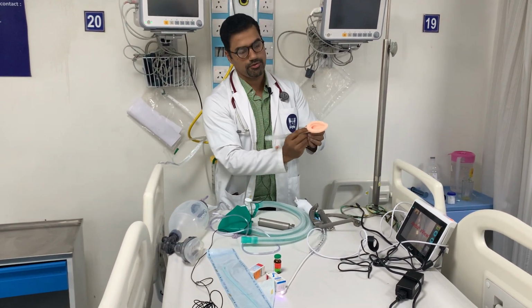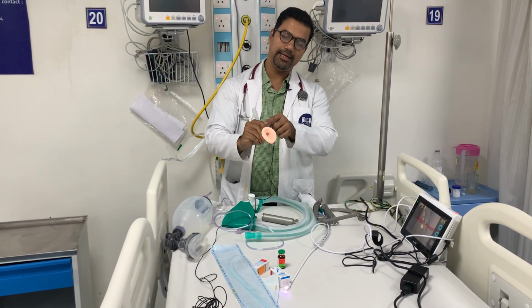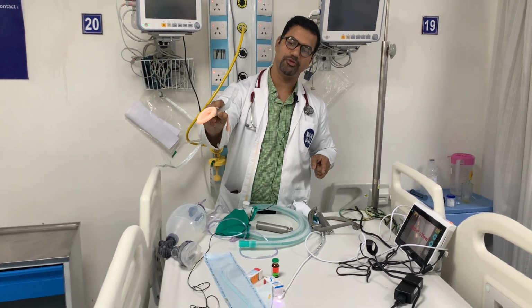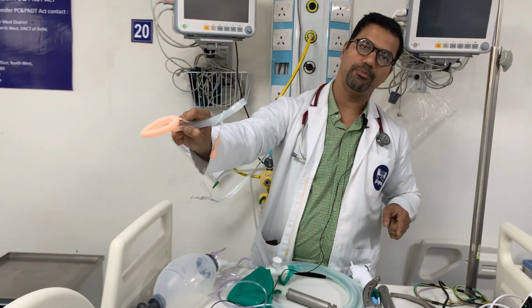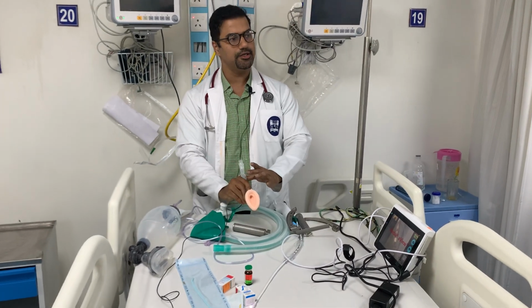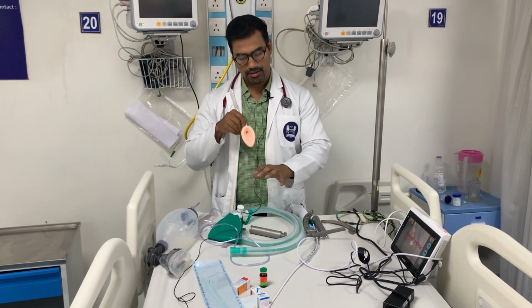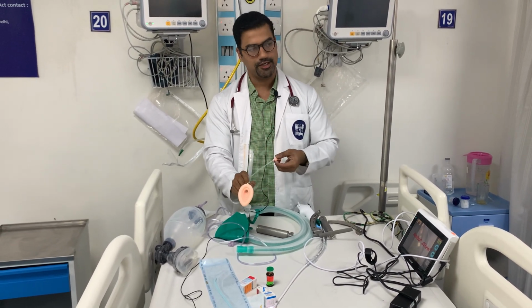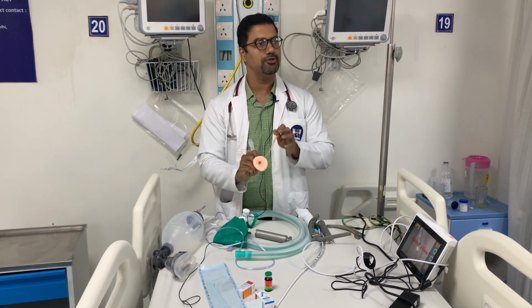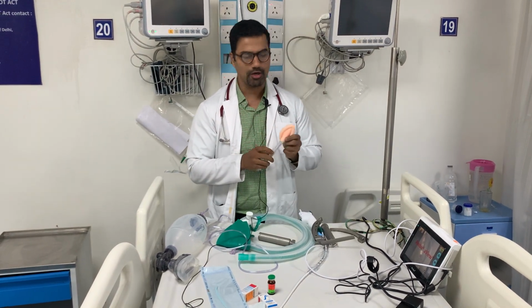How do you use it? You just hold it like a pen. Your index finger should be here and then the thumb should be at this position. Just show it nicely. This should be the position you should hold a laryngeal mask airway. Open the mouth, just glide it in. This should be anteriorly. Okay. Just push and hold it and just push it in and then just inflate it. It should be inserted in a semi-inflated position and then once it goes inside, you should inflate it. Okay. There are various kinds of LMAs which we can't discuss in this small class.